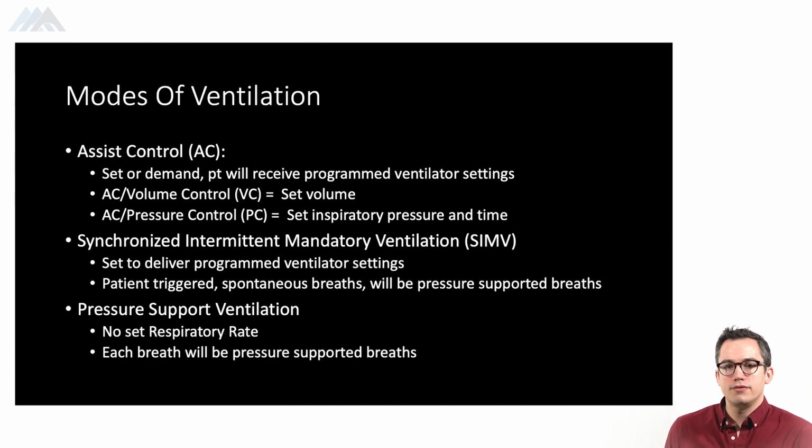Both of these modes of ventilation are going to deliver the specific settings that we talked about. The major difference between the two is that in volume control, you're going to preset the volume, so every breath that you have it set to, they're going to get that set volume.